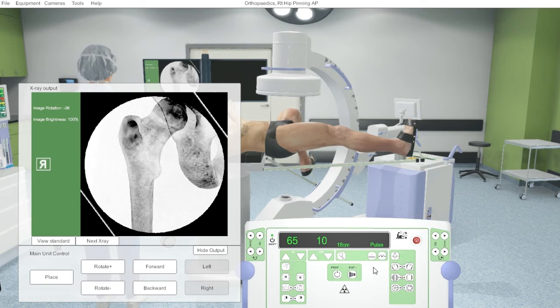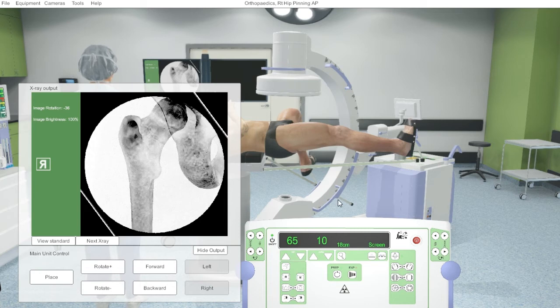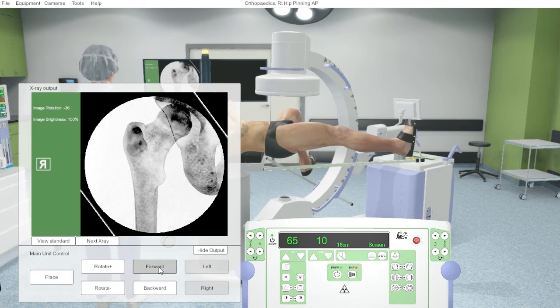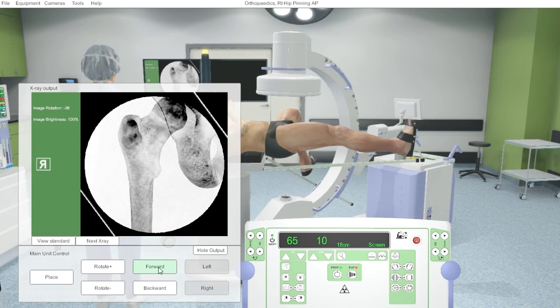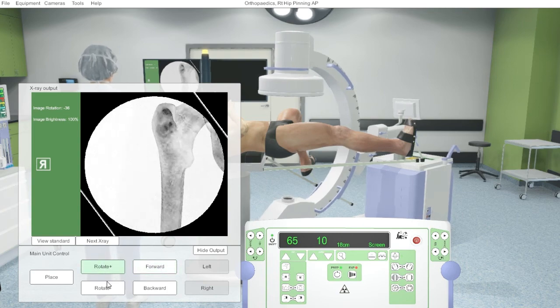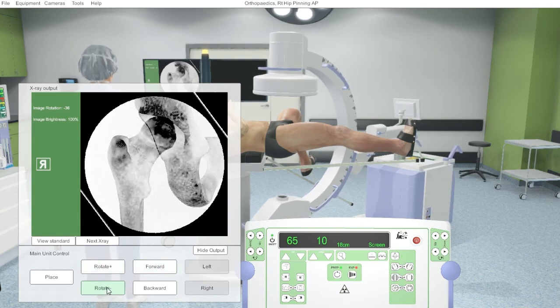We also have the ability to go from pulse to screening. So when screening is selected, when the exposure button has been pressed, you can then have the live screening on the monitor. So any movement of the C-arm will result in a direct image change.